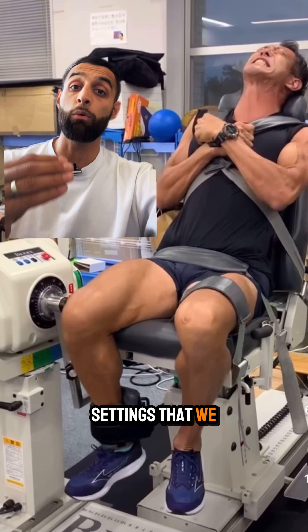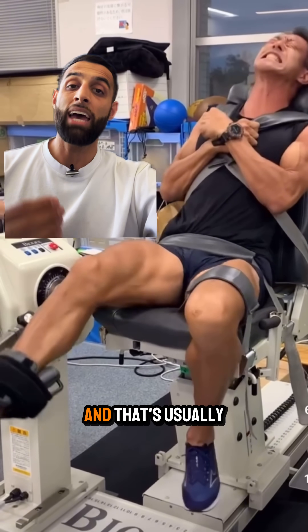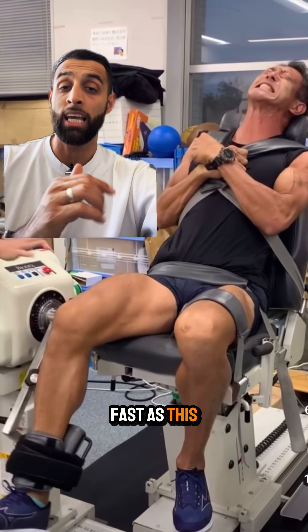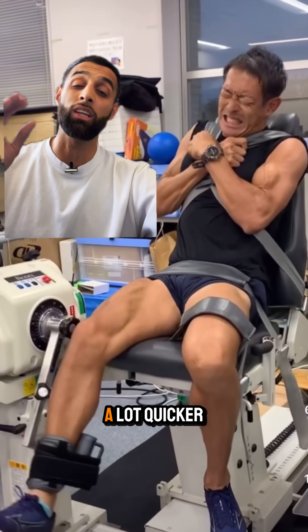There's another setting where we want to see how fast he can move, and that's usually around 180 degrees per second — about three times as fast — and you'll see his legs swinging back and forth a lot quicker.